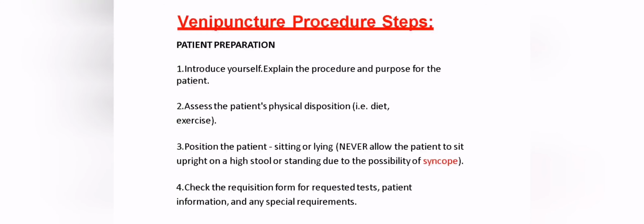After all equipment is prepared, venipuncture procedure can begin by introducing yourself, explaining the procedure purpose to the patient, and assessing the patient's physical disposition. Position the patient either sitting or lying, never allow the patient to sit upright on a high stool or stand, due to possibility of syncope. Check the requisition form, request to test, patient information and any special requirement.